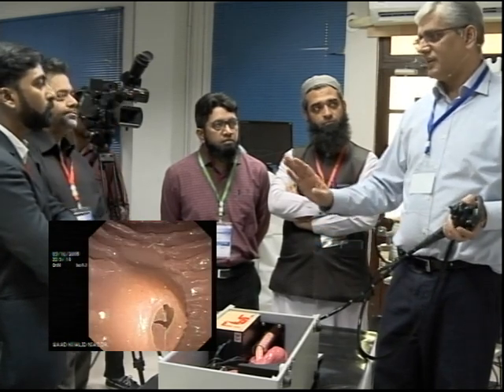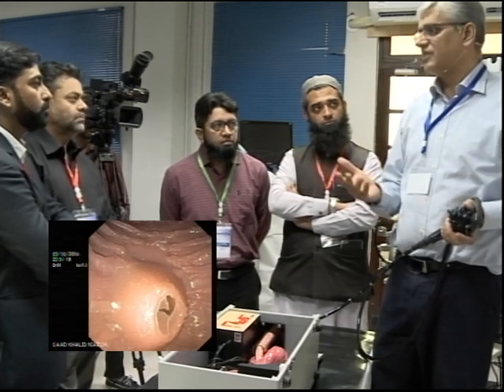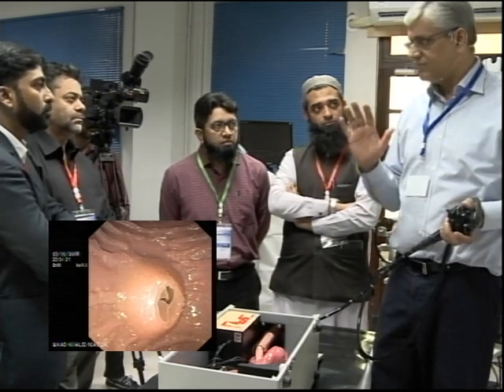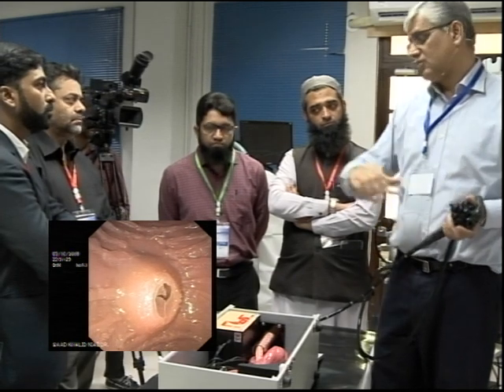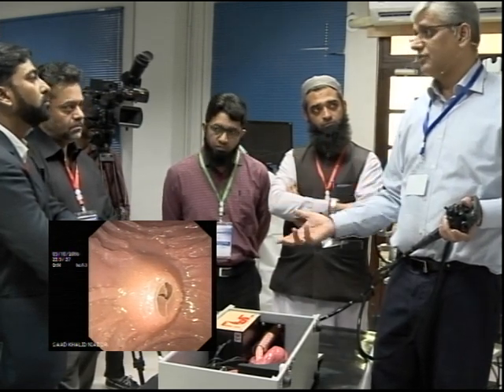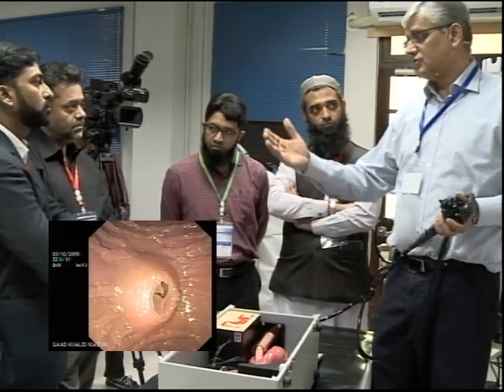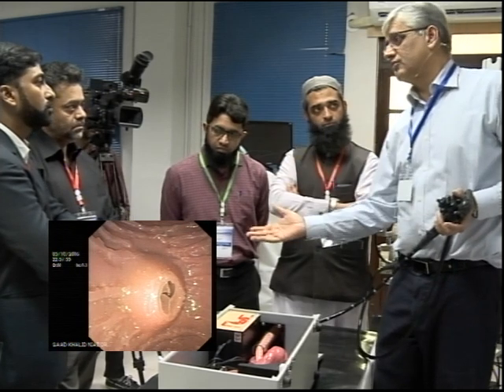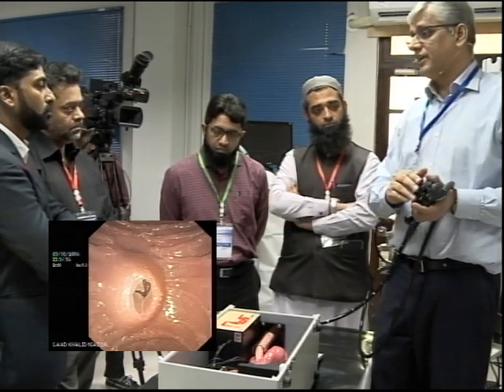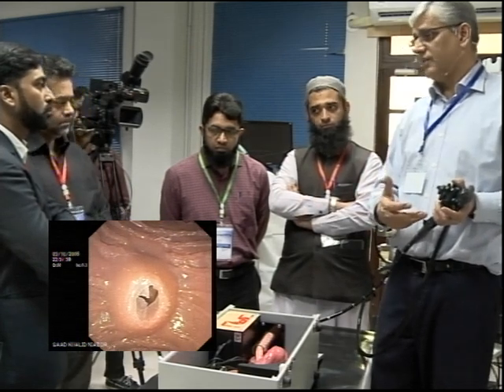When you are doing ERCP, don't rush, brother. Especially in your first 500 cases or maybe first 1,000 cases, just give yourself time. There are perforations that have occurred in the duodenum because of that. So you have to be gentle. Most of the time, you can actually see what you're doing. What I'm trying to explain to you is much easier in the human than here, okay?